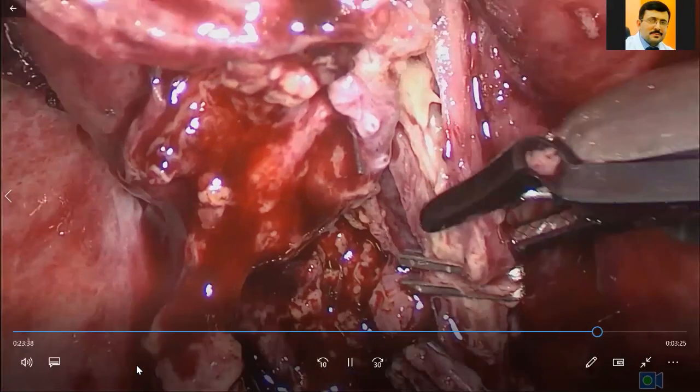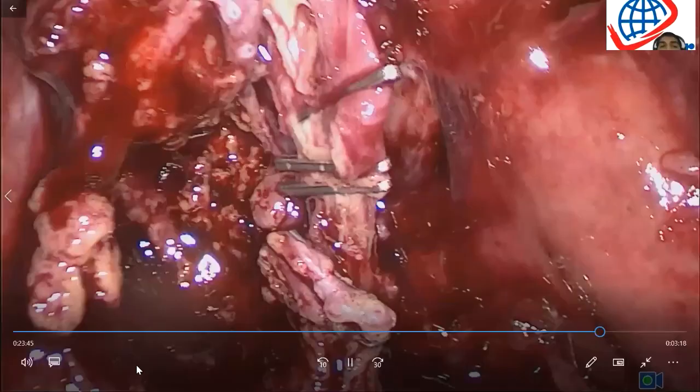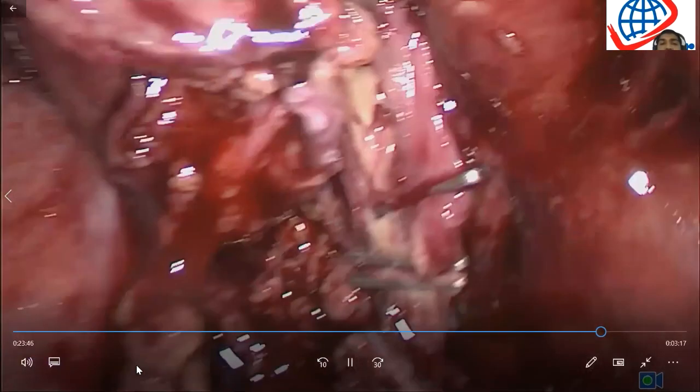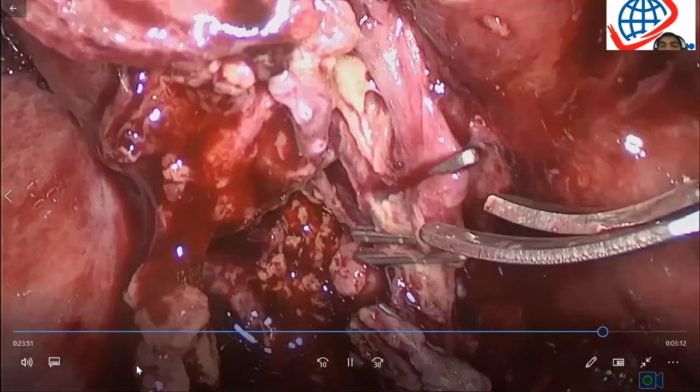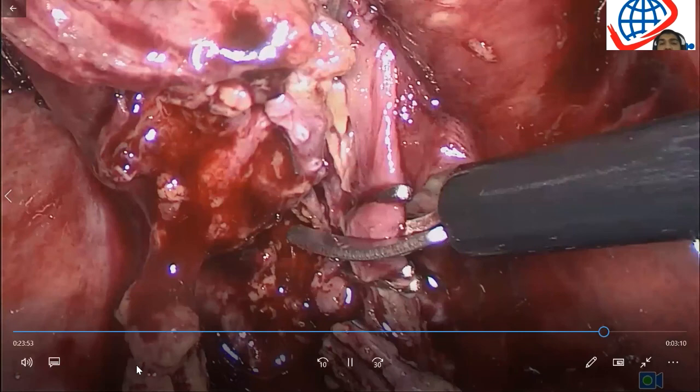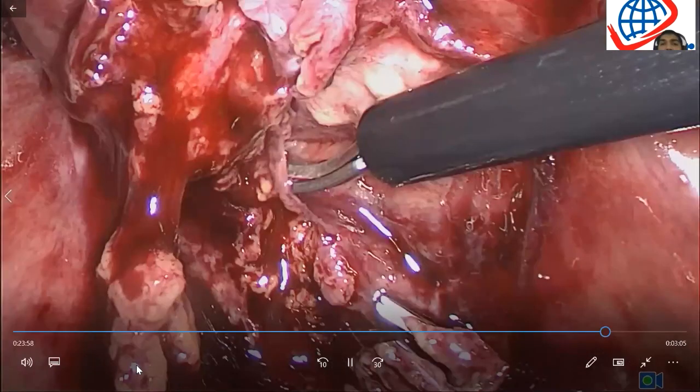In some cases as well, you will see that the posterior wall of the gallbladder is densely adherent to the liver. And no matter what you do, it just doesn't want to separate. And if you continue separating, you will cause more and more liver injury.